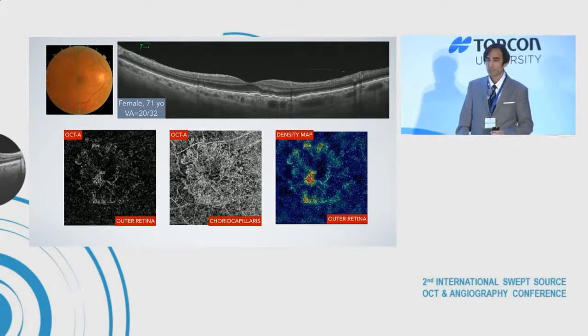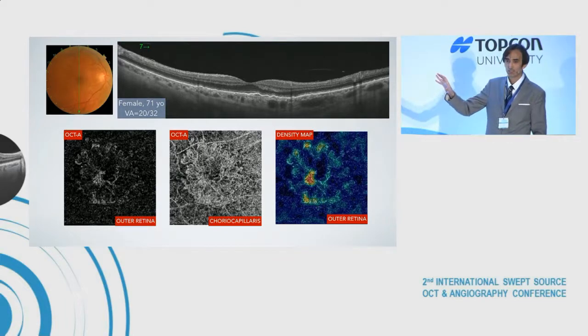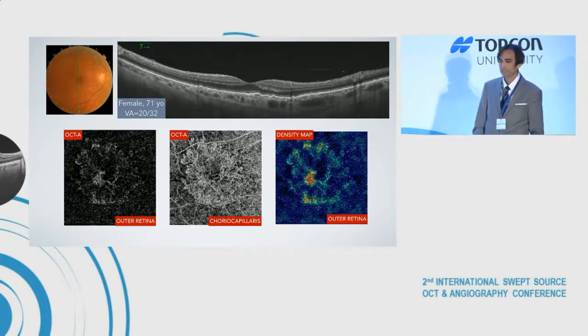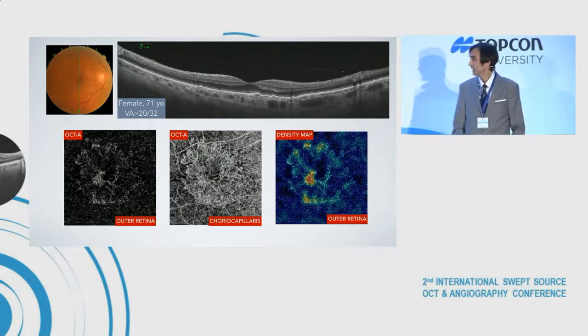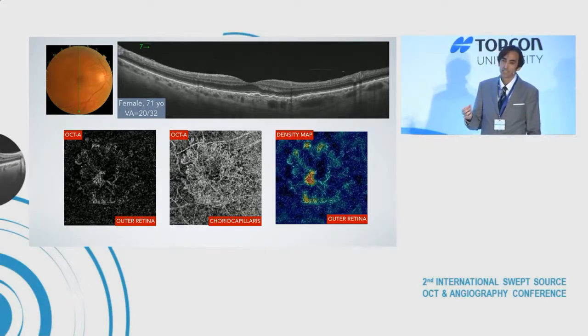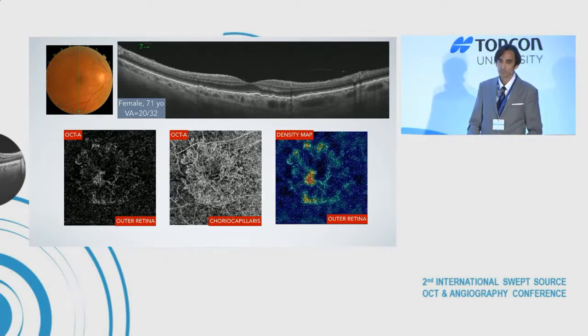On the other hand, it's important to know that the OCT angiography can show very clear neovascular complexes like this in these cases in the absence of macular fluid at any time. Therefore, the term neovascular appears to be more convenient than wet or exudative to name this disease.